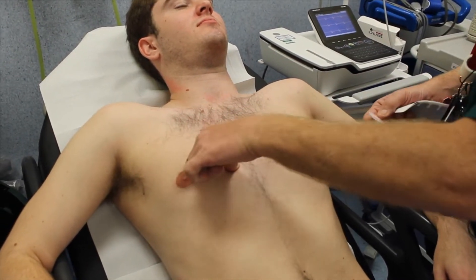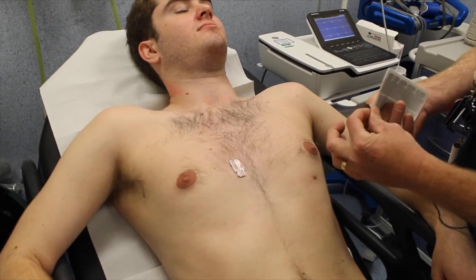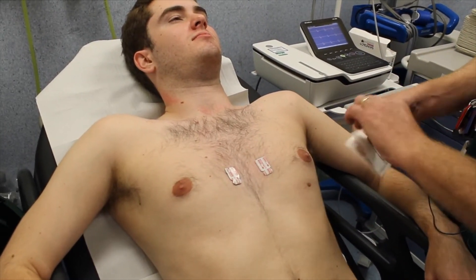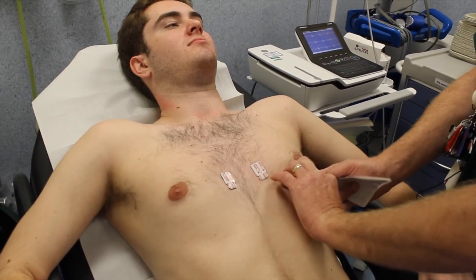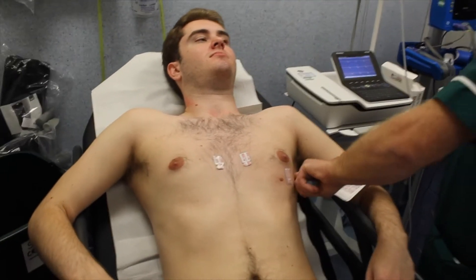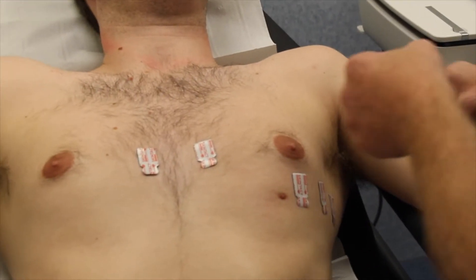What I'm doing is feeling for your fourth intercostal space and placing one lead there. Then finding another intercostal space — on the fourth — then coming out to the fifth rib and moving across, tracing that fifth rib. We've got five stickers on now.